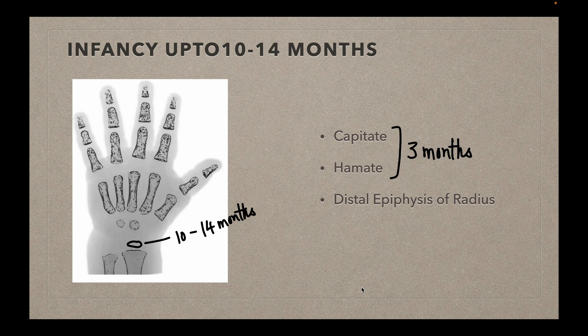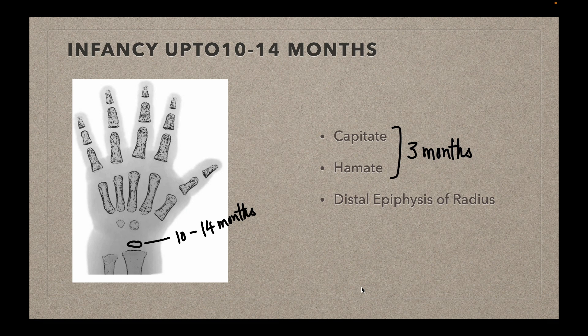The first stage is infancy, up to 10 to 14 months. In the x-ray of the hand and wrist, we look at three things. Two carpal bones develop almost at the same time — capitate and hamate — appearing at around three months of age, though capitate may develop slightly earlier than hamate by about half a month. The distal epiphysis of the radius appears at around 10 to 14 months. Where a range is mentioned, the lower limit corresponds to females and the upper limit to males, due to the effect of estrogen.